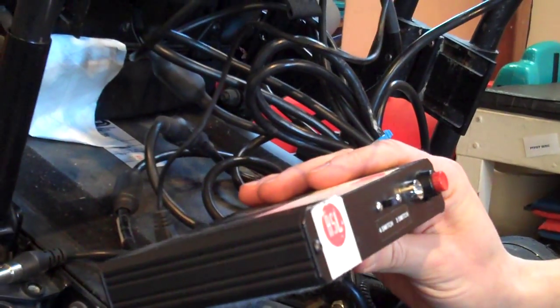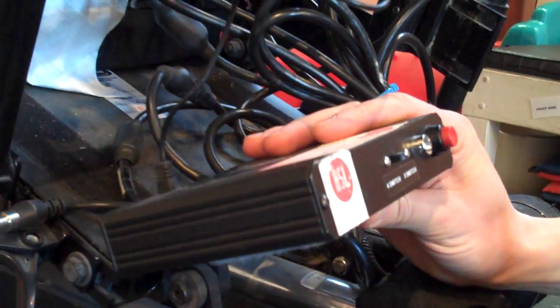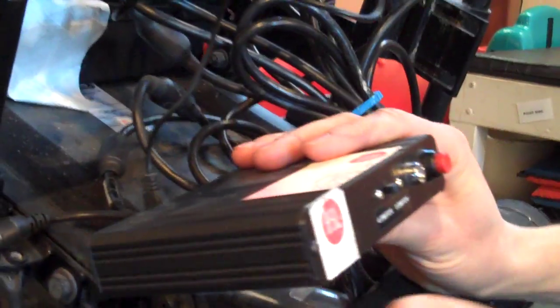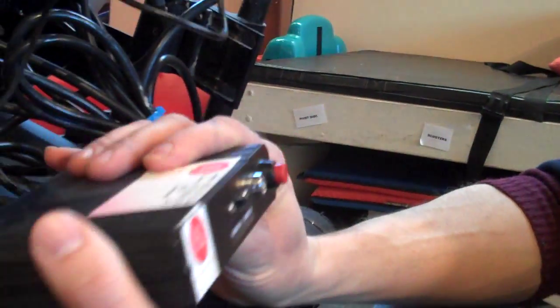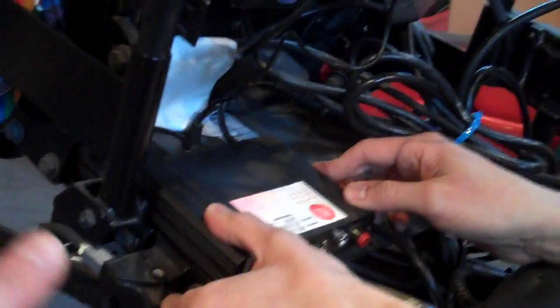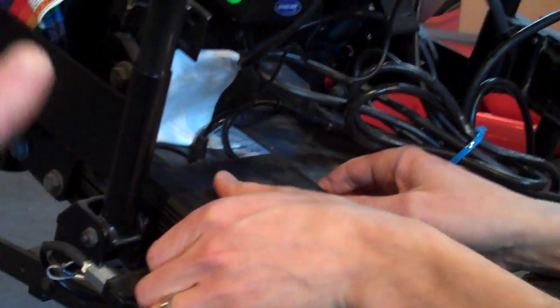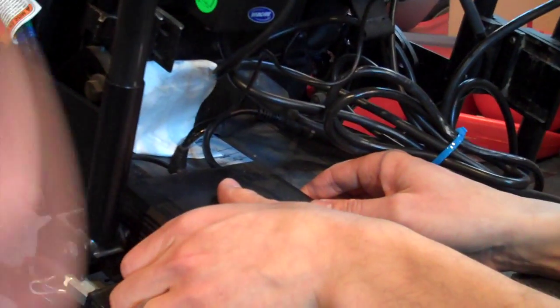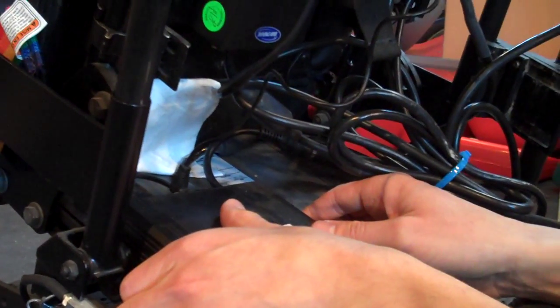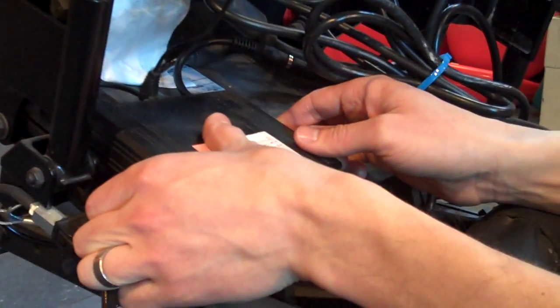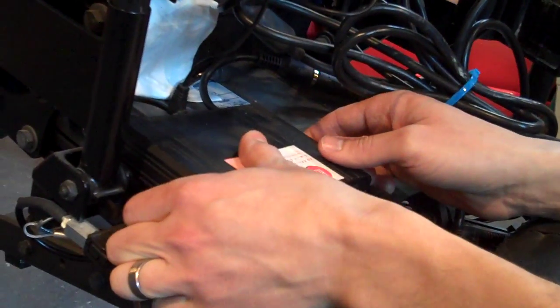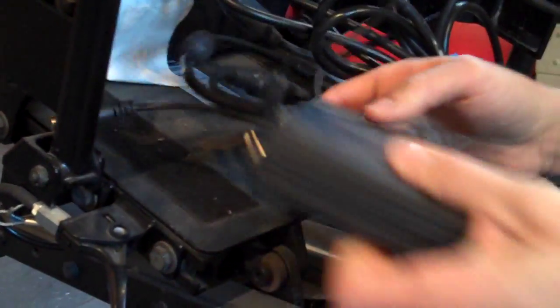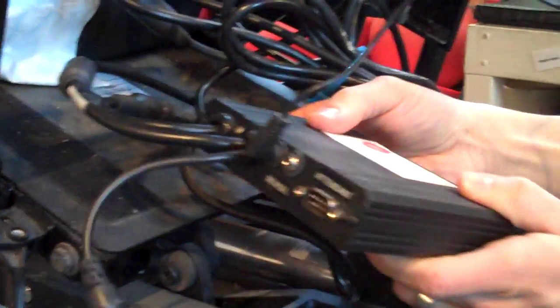So I would call them and say I have an Invacare with Mark 6 electronics, and they would give me a box for Invacare Mark 6 electronics. Does this box do anything else other than connect the head array to the electronics of the chair? You can connect other types of switches to the chair.